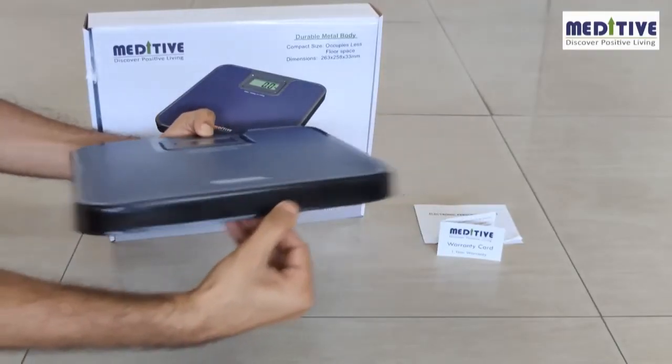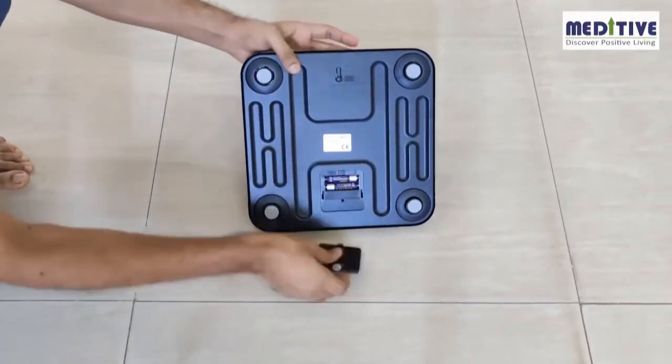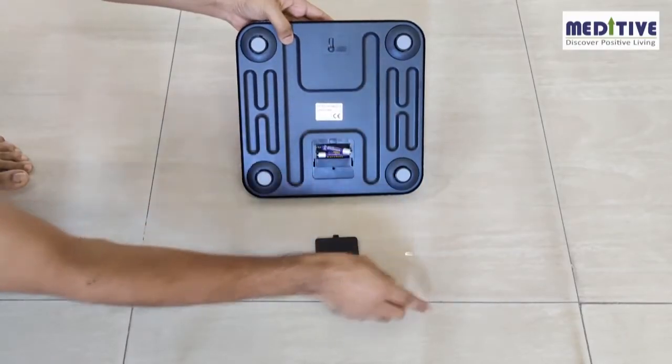The edges are curved so that there are no sharp points, ensuring safety whenever it is kept on the floor. The scale is powered using two triple-A batteries. First, please check if there is a plastic cap behind the battery compartment — you have to remove that plastic cap.